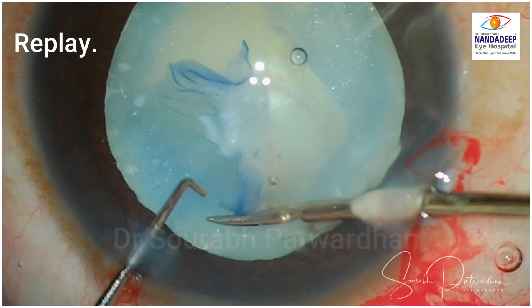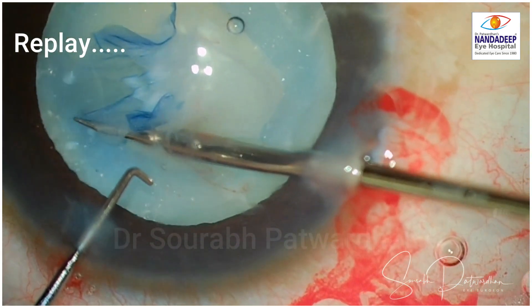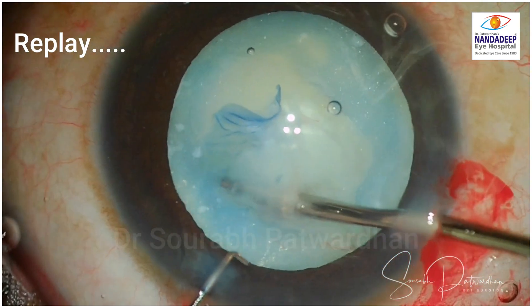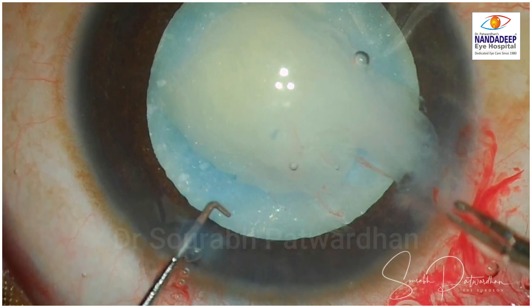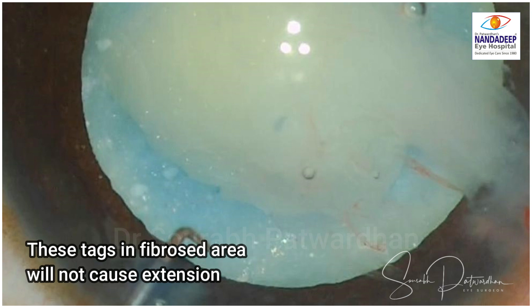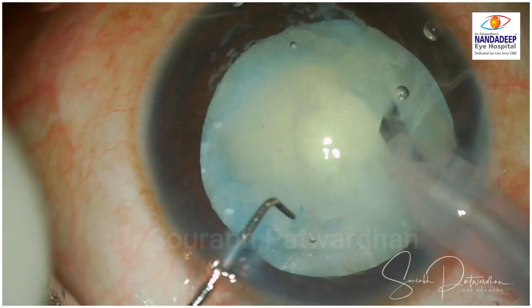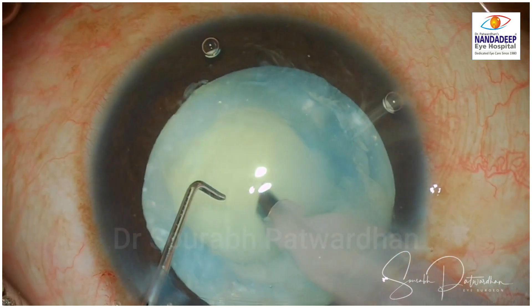You try to cut just prior to the tear so that you don't leave any edges or tags when you cut and create the capsulorhexis. You can absolutely make a continuous CCC with these forceps if you apply your skill. Here you can see I could complete the capsulorhexis. Now you can see those tags — these are not ideal in a normal capsulorhexis, but when the area under the capsule is fibrous it is not going to cause any extension, so I am not worried. I will just leave them alone. This is a great instrument — make sure you buy one immediately. I will share a video later where my colleague made a complete capsulorhexis using only these micro scissors where the capsule was completely fibrous.